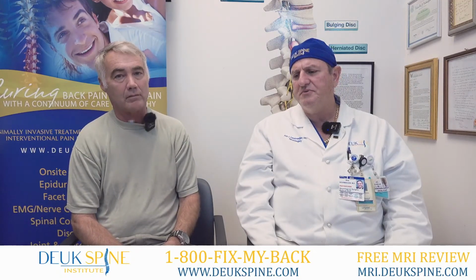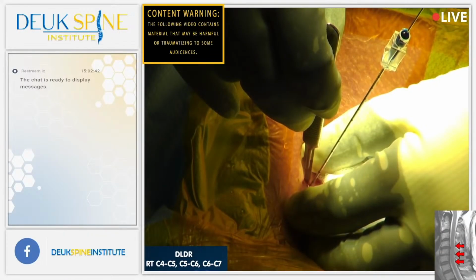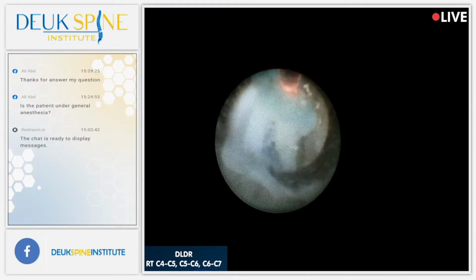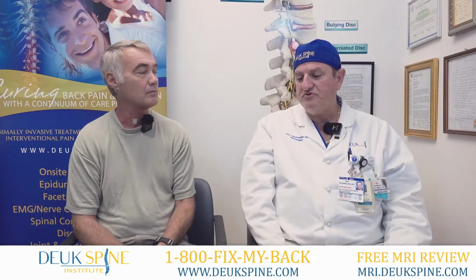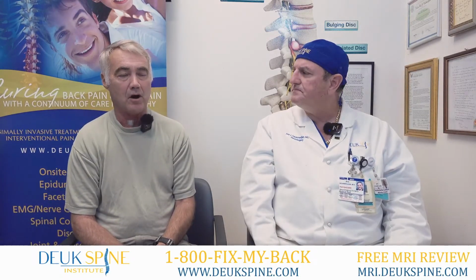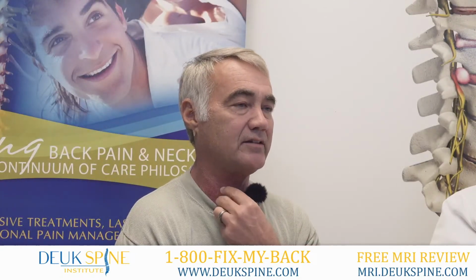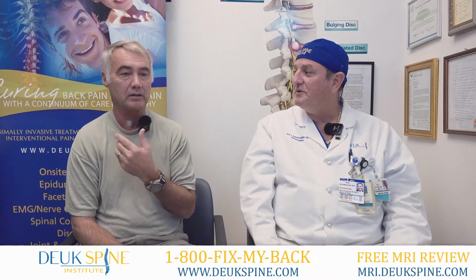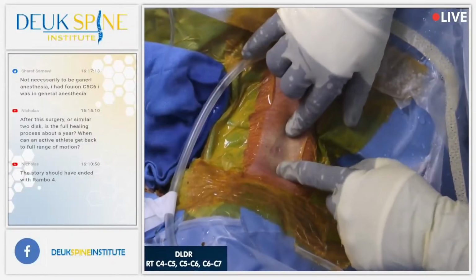So you got 3 discs repaired yesterday. You can actually see right here in this video footage how small the incision is, tiny. I was in there endoscopically using a laser to clean out the tear and remove the small herniations. We sent you home an hour after your surgery, and here you are back today. And how much of that pain did we get rid of? All of it, Doc. 100%. They did surgery on 3 different levels, through a really small hole. 4 millimeters. Incredible. And there are no stitches, just a Band-Aid.